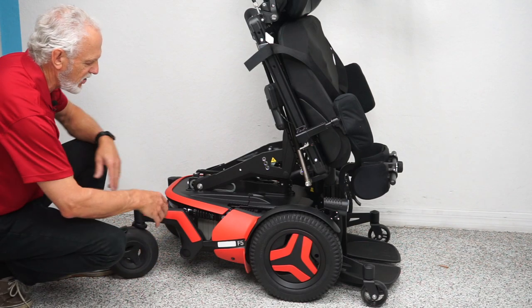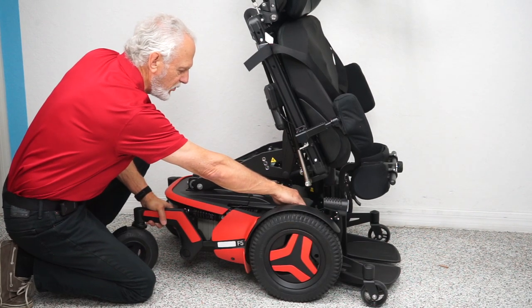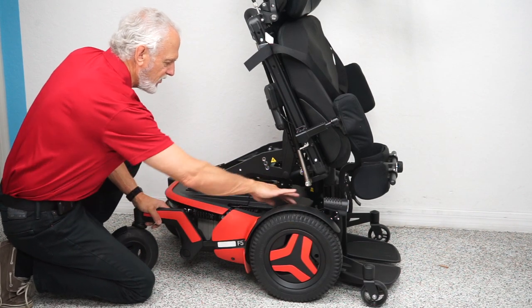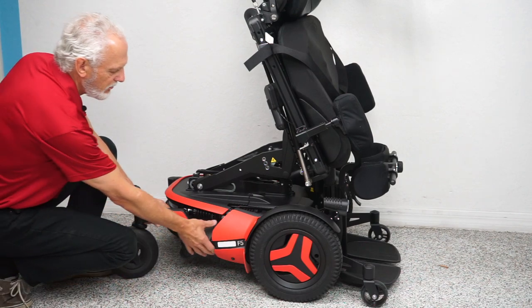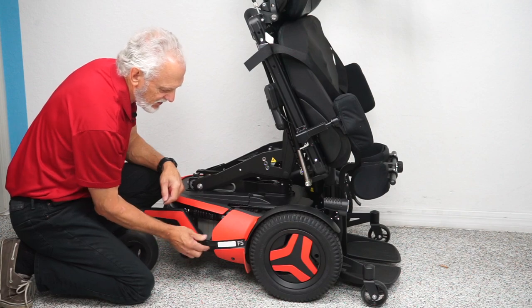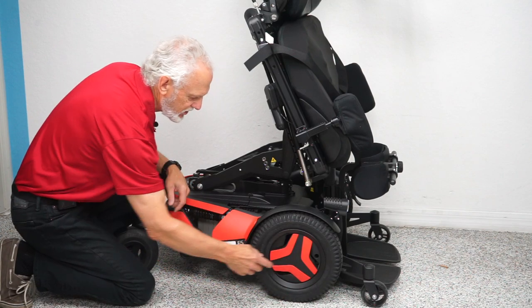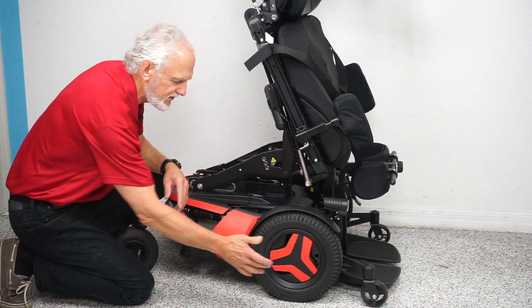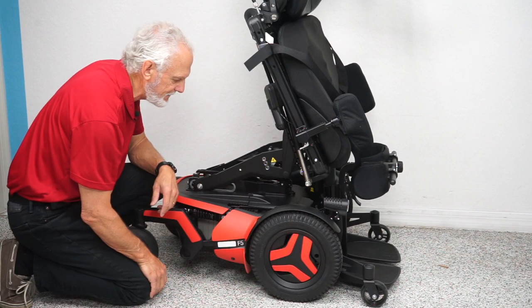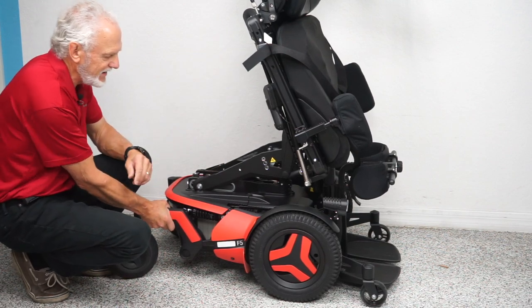You have anchor points inside here, and another one here — this is where you secure the chair for transport. There are four anchor points. You have a motor for each wheel. You can't see the motor because it's behind the fender, but the motor goes this way and it's hooked up directly to the wheel — no chain, no belt, it's direct drive.